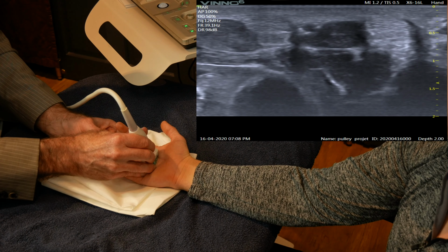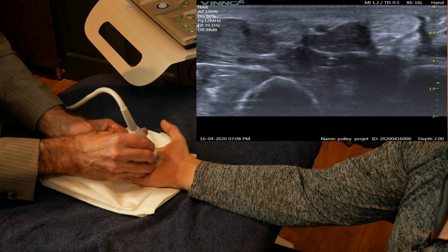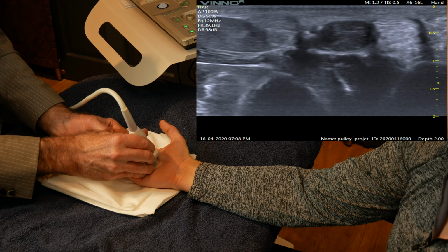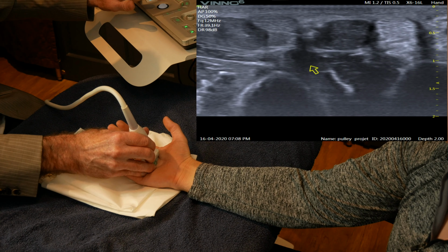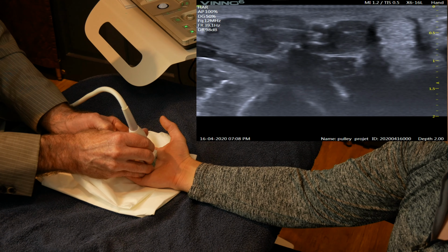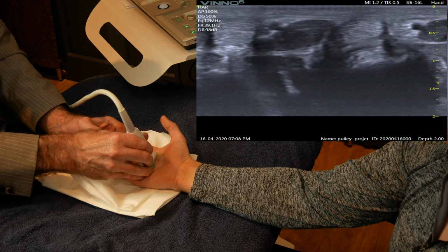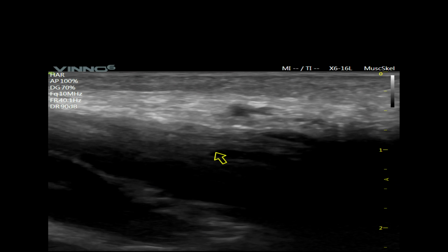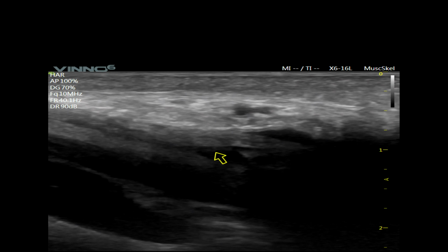So pull that finger up against me, harder to the ceiling, pull, and now the middle finger, and you can see the tendon structures moving just through this area here. Pull up, but everything is stable, and if there's an injury, you're likely to actually see some instability in this region. This type of injury doesn't seem to be represented in the literature at all.